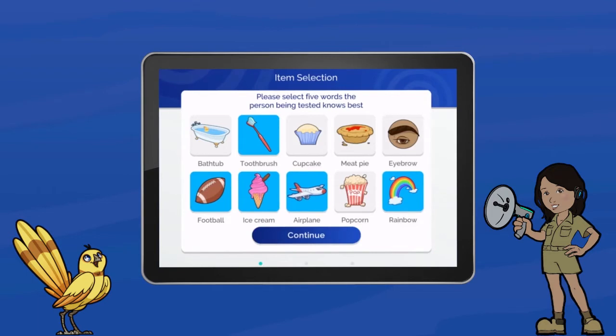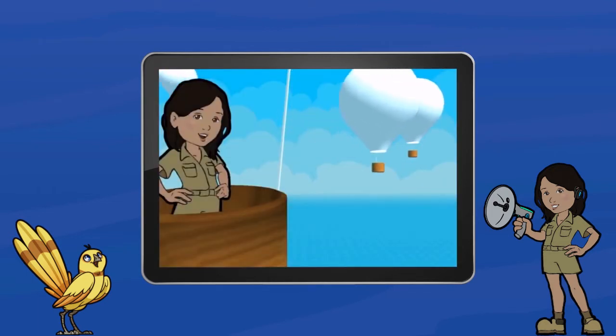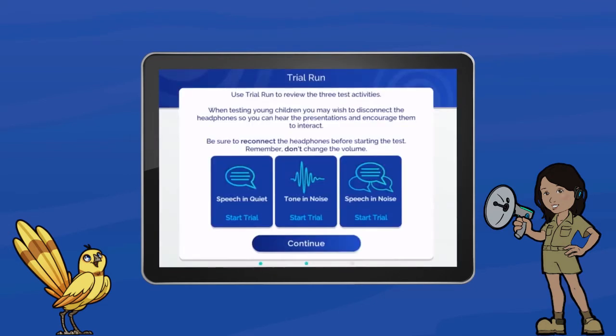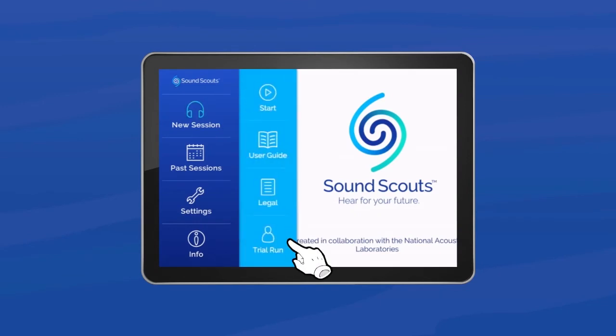Once you're set up to play, go over the trial run with your child. This is a quick activity that helps familiarise your child with the game. You'll see the trial run as you progress through the setup. You can also find it under the Info tab.